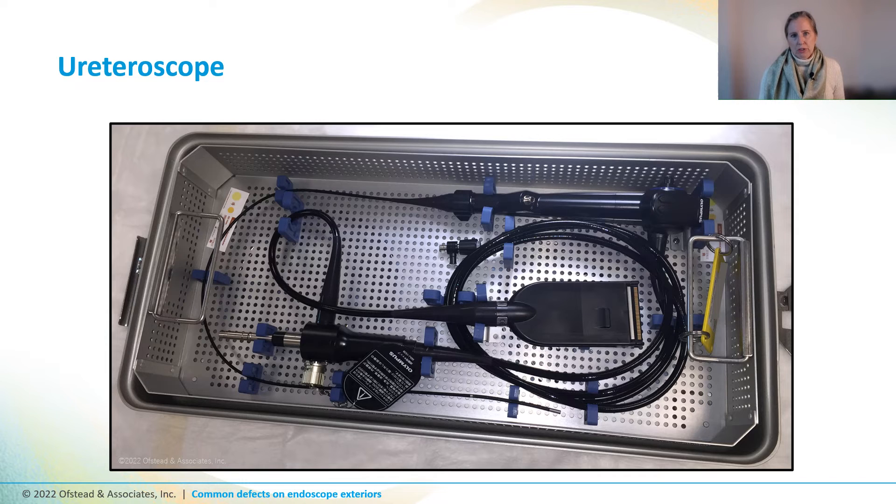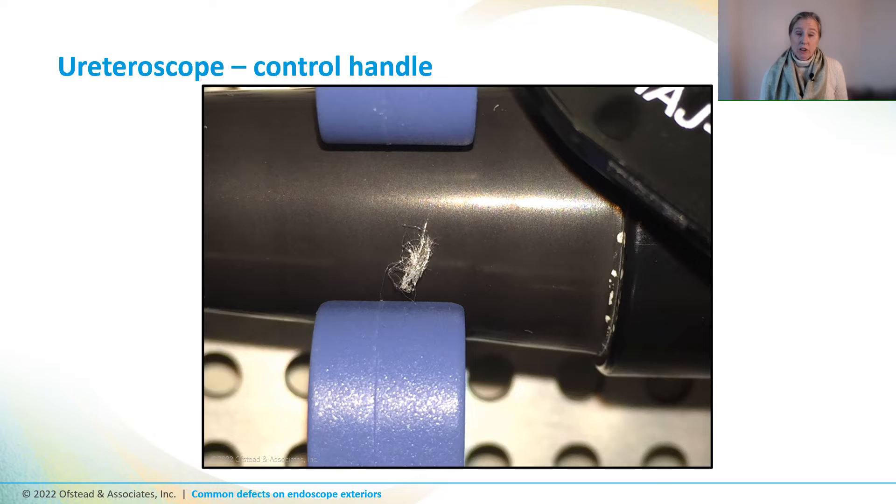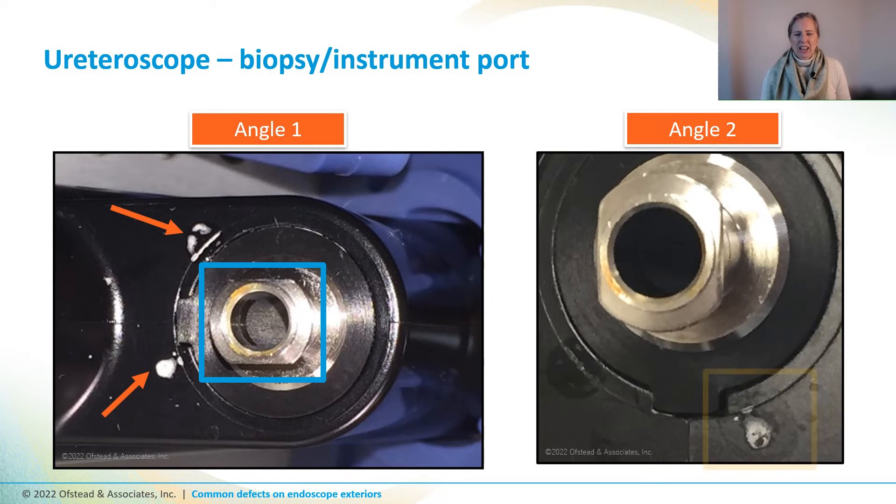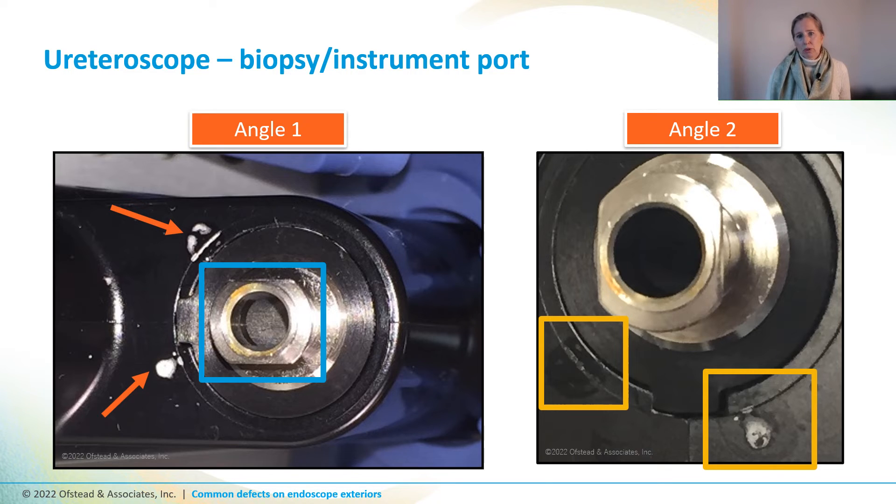Here's a ureteroscope still in the tray used to sterilize it using hydrogen peroxide gas. There's a clump of white fibers on the control handle and white stuff along the groove, plus rusty or brown colored residue in a crack — it still looks dirty. There are also blobs of white residue near the biopsy port and yellow residue on the biopsy port rim. Other experts said that the white blobs could be reprocessing chemical residues or possibly adhesive that came out of the grommet area during the sterilization cycle.